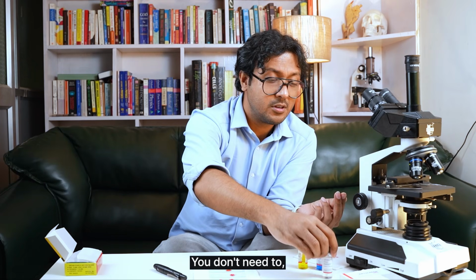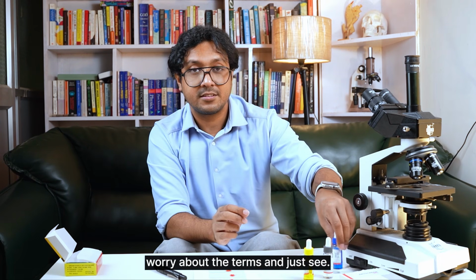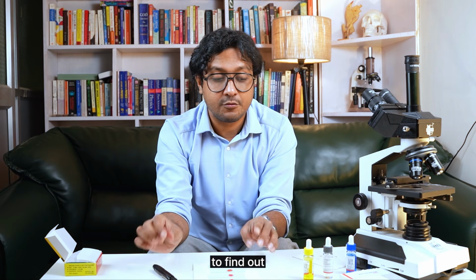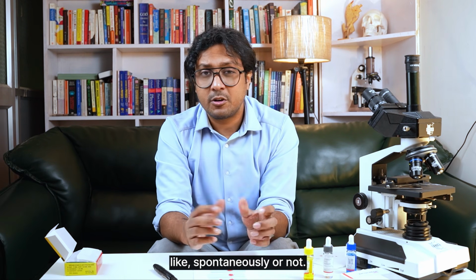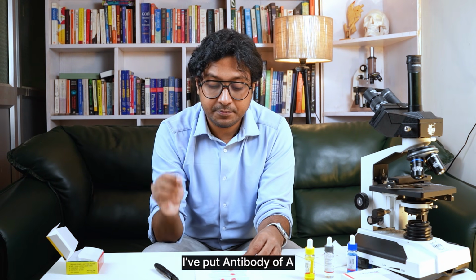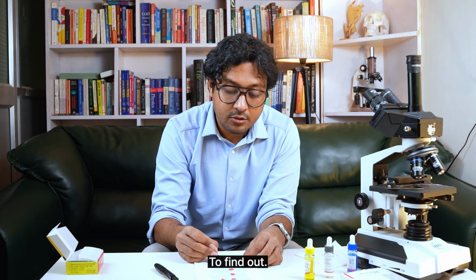You don't need to worry about the terms. I've kept two extra drops of blood to find out whether they are clumping automatically, spontaneously, or not. I've put anti-A, meaning antibody of A. I'm mixing it to find out.